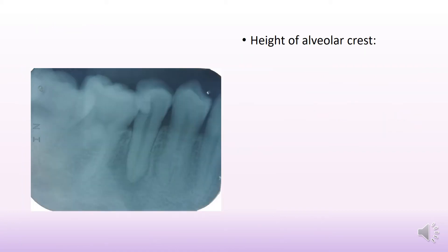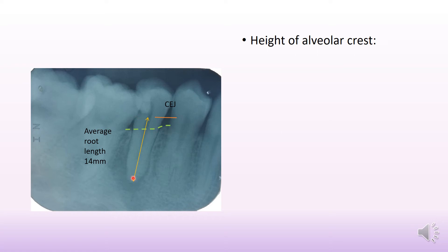Moving on to the height of the alveolar crest: since our tooth of interest is 45, we revolve around 45. The green line indicates the height of alveolar crest, and the orange line indicates the CEJ. Given that an average root length of a first mandibular premolar is around 14 mm, the loss of bone is about 3 mm, and hence the height of alveolar crest is around 3 mm below the CEJ for the tooth of interest.